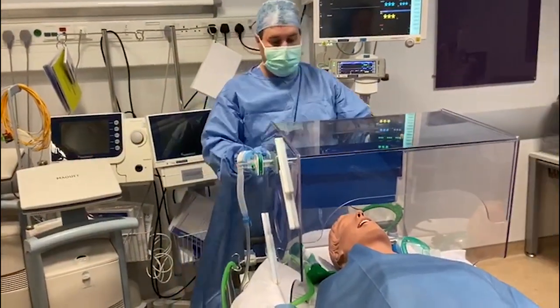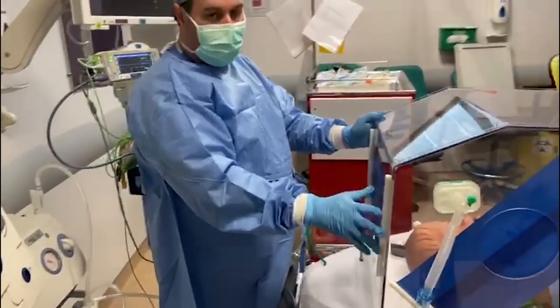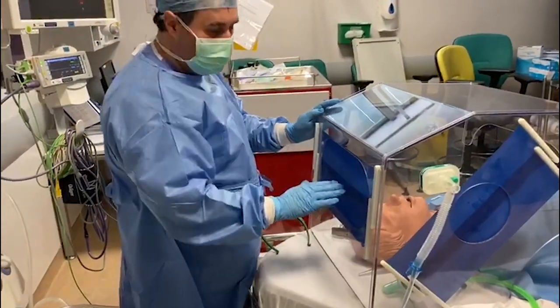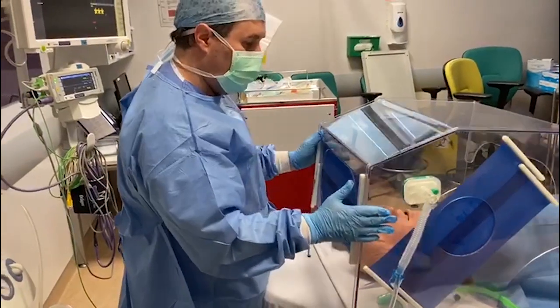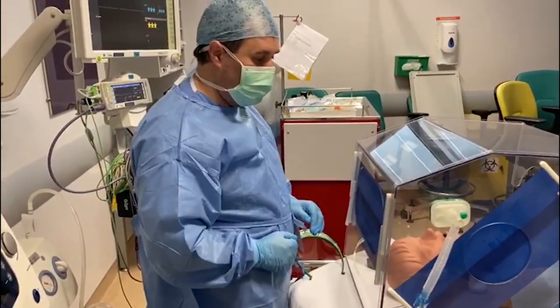This also applies to the head end, which is one large opening as opposed to two small arm openings in the original design, so you've got a huge amount of range of movement. Compared to two single openings, the bands across here mean that it self-seals.